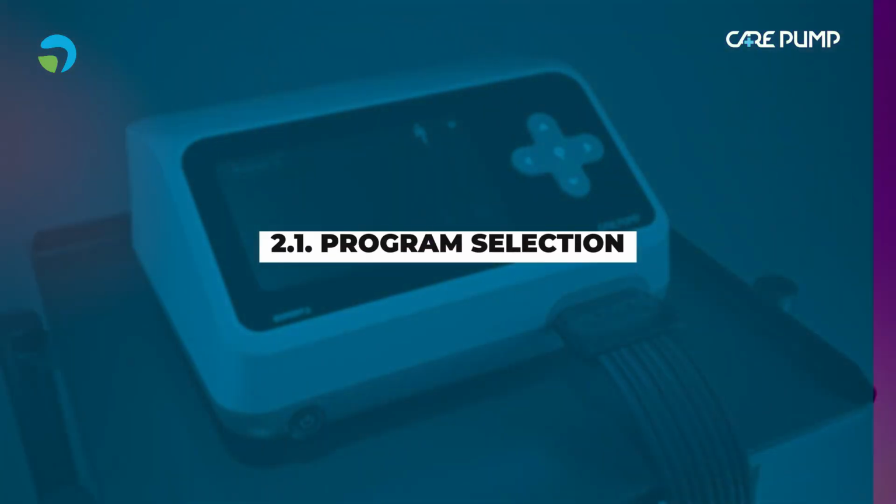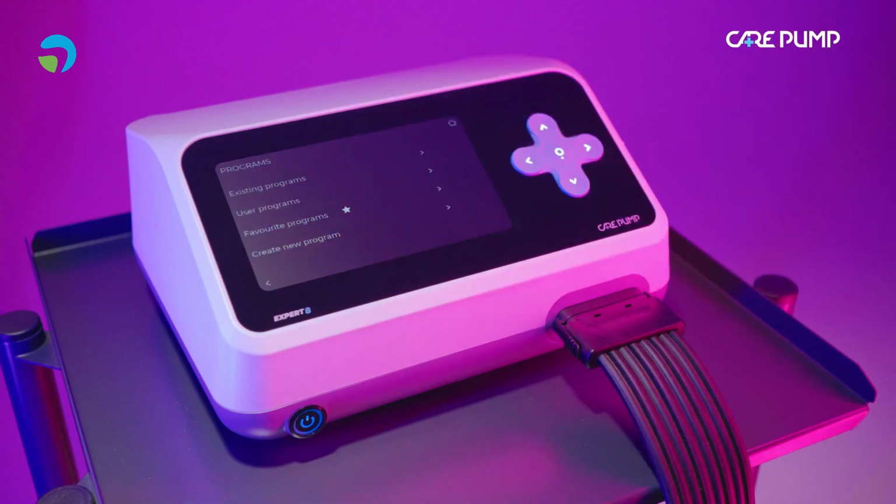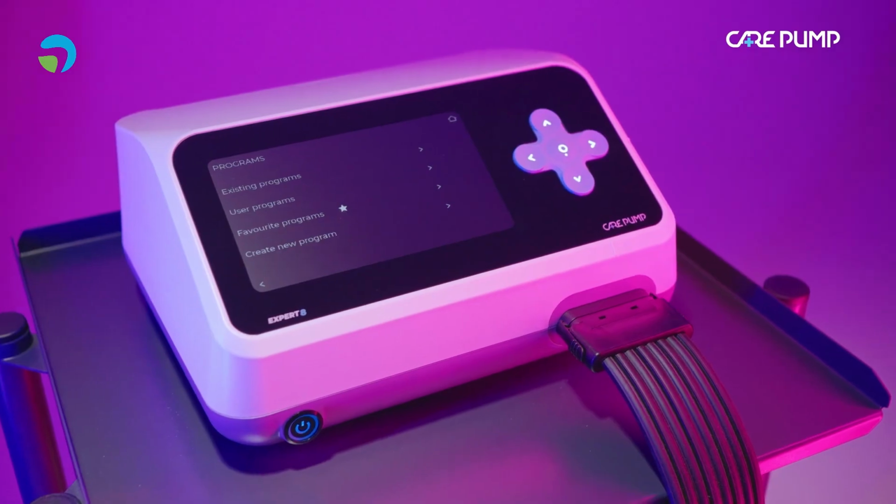Program selection. Press Program icon. On the screen, you will see the menu where you can choose a program from existing programs, user programs, favorite programs, or create a new program.